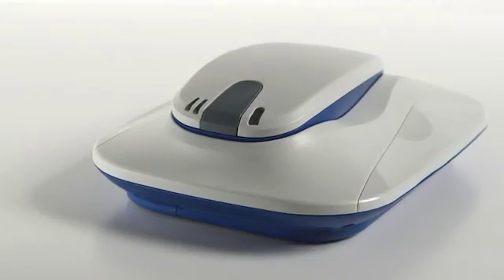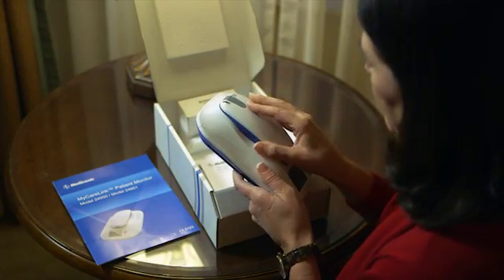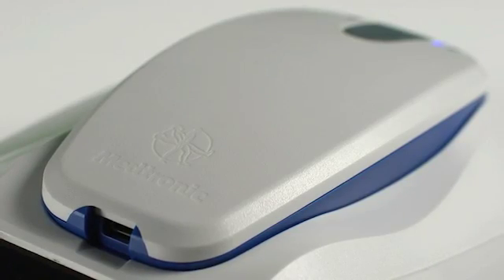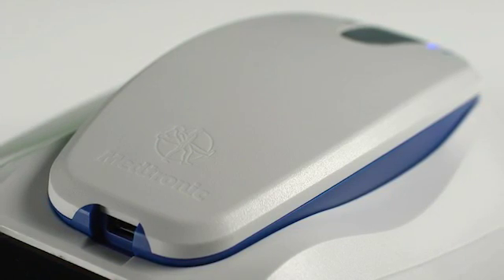The first thing you'll want to do when you get home following the insertion of the Reveal Link cardiac monitor is to set up the other necessary component to the system — the MyCareLink patient monitor. Proper setup of the MyCareLink monitor is necessary for the system to work, because this is the only way to move the heart information from the Reveal Link to a location where your doctor can review it. The MyCareLink monitor will keep you connected to your doctor wirelessly and automatically.